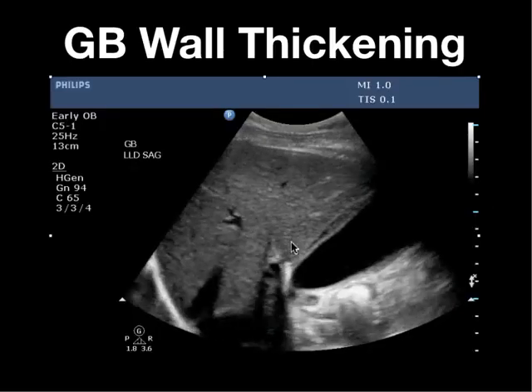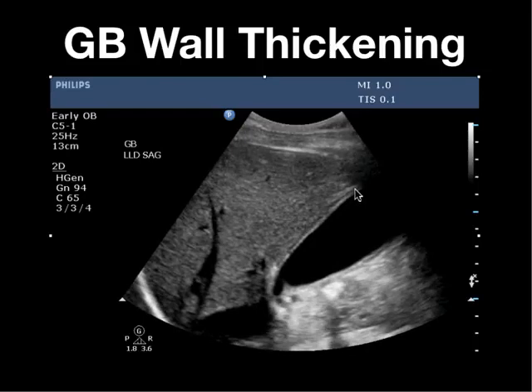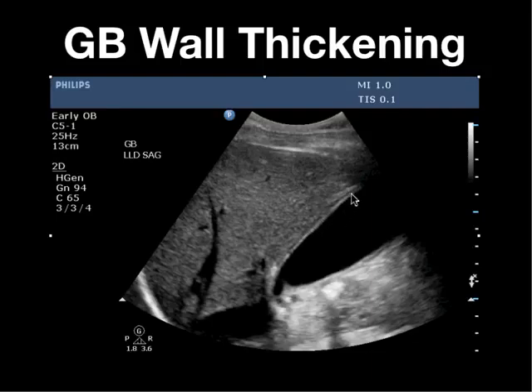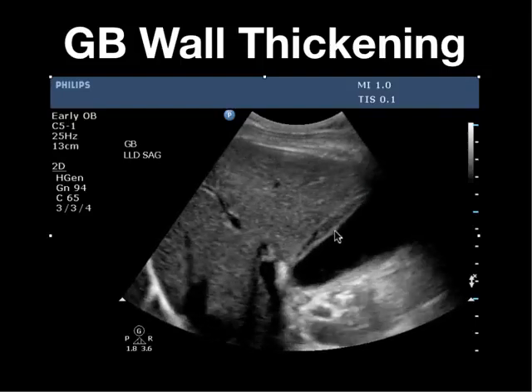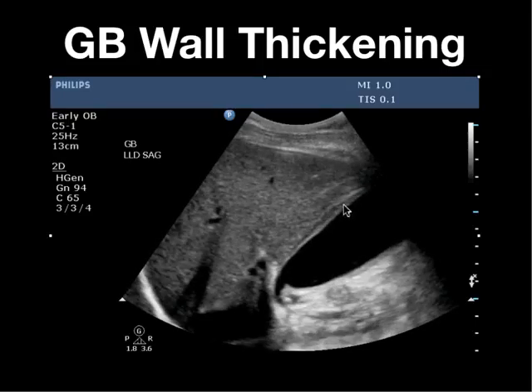Here's a patient with gallbladder wall thickening. You can see the wall, but it's not uncommon to see a central hypoechoic area in the mid-portion. At first glance you may want to say this is pericholecystic fluid, but you really want to trace the whole outline of the gallbladder. This was the outer wall of the gallbladder — this was just some edema in the mid-portion, so there was no pericholecystic fluid, just wall thickening.